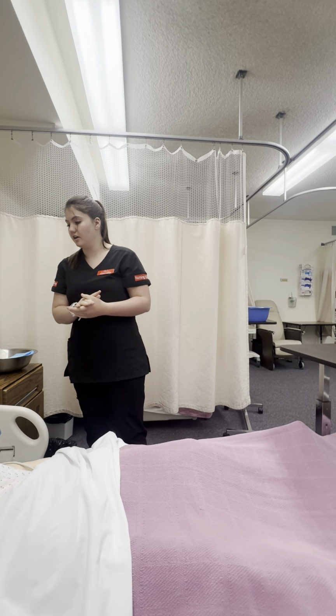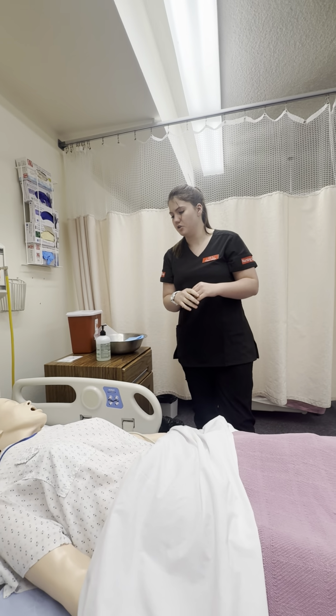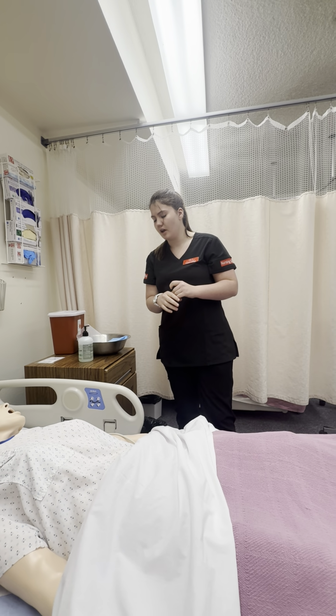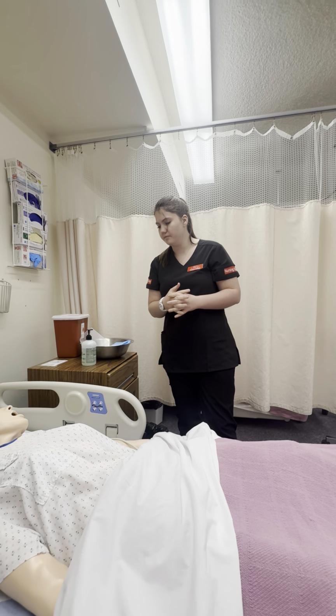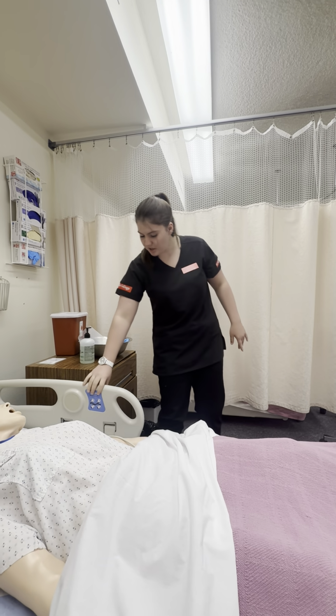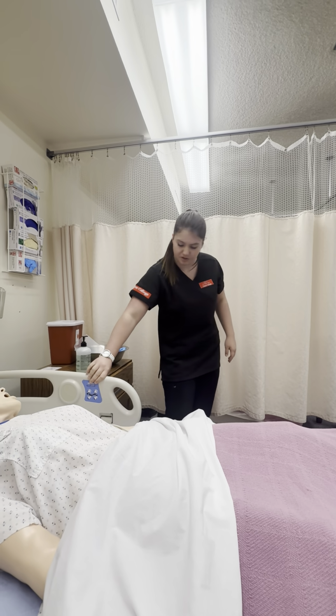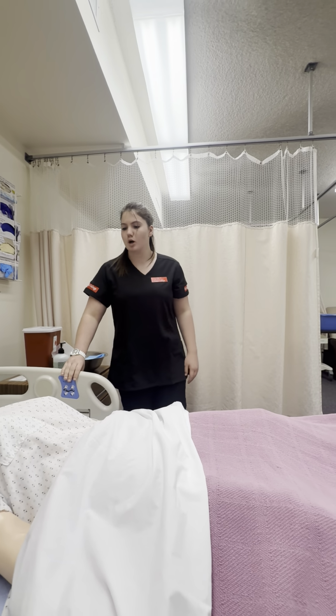Okay. Do you have any other allergies to food or meds? No. Maybe to adhesives or latex? No. Any environmental allergies at all? No. Okay, wonderful. All right, just the betadine. All right. Well, I'm going to go ahead and raise you up just a little bit. I'm going to make sure that your bed is locked before we get started with the procedure. I'm just going to raise you up to a more comfortable height.